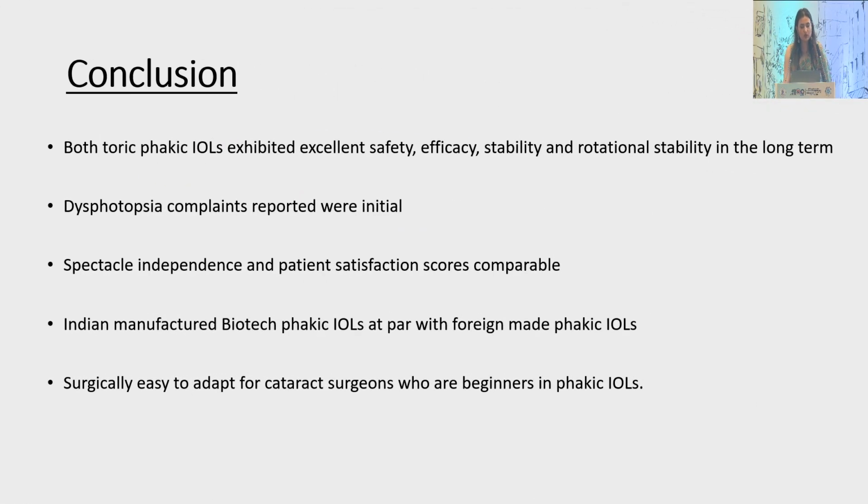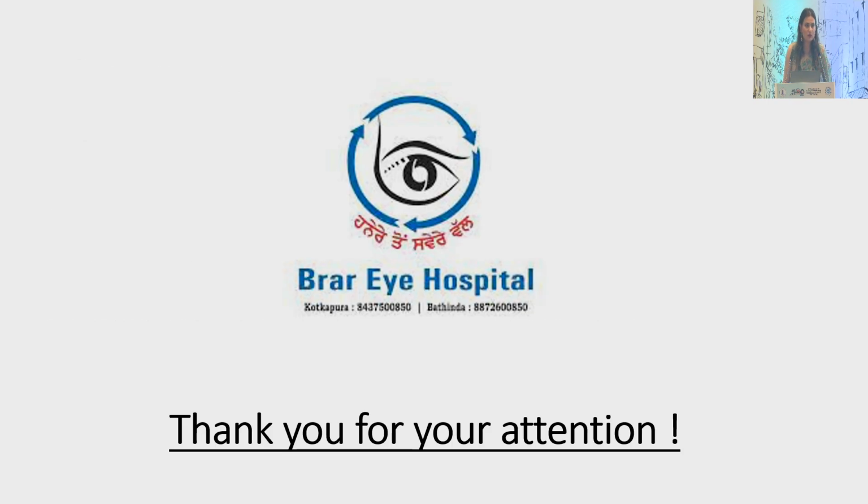So to conclude, both toric phakic IOLs exhibited excellent safety, efficacy, stability, as well as rotational stability. In the long term, spectacle independence and patient satisfaction scores were comparable. So we can safely say that Indian manufactured biotech phakic lenses have fared at par with the foreign made lenses, and especially for those surgeons who want to start with their phakic IOL practice, I think these are the easiest lenses to adapt. Thank you so much for your attention.